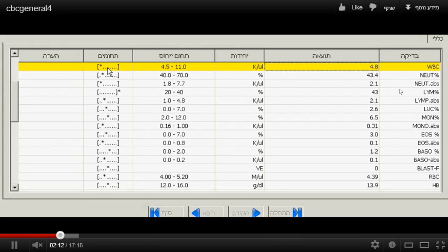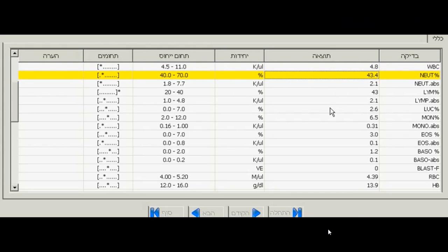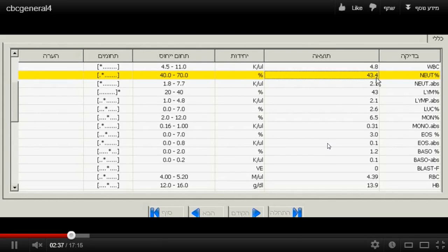Some of the white cells, like the neutrophils, for example, have a very short half-life of around 7 hours, and all these things can increase and decrease according to the viral infection or just general exercise or other things. Note that her neutrophil count, which are cells that fight infection, are also close to the bottom limit of the reference interval.